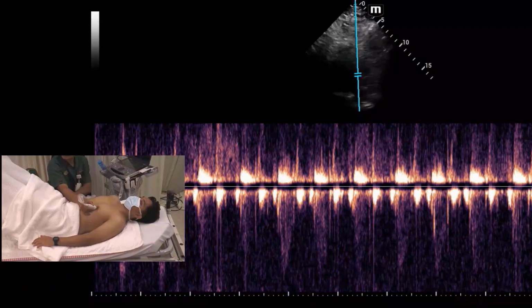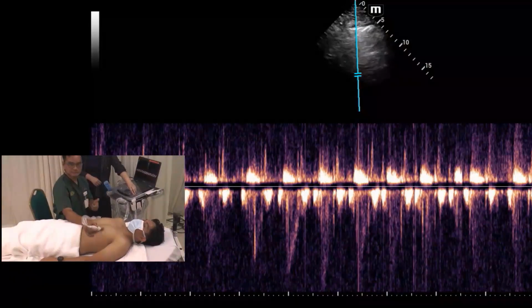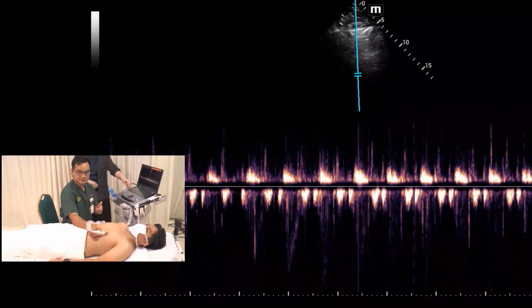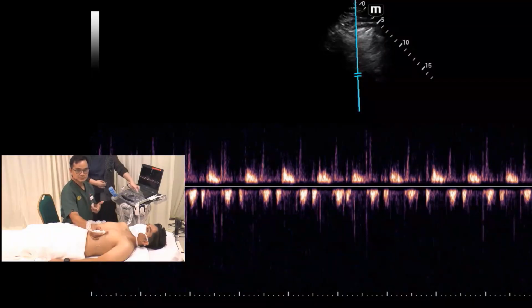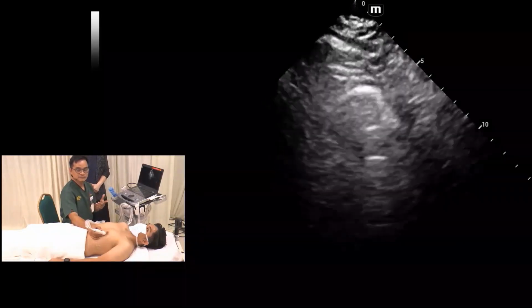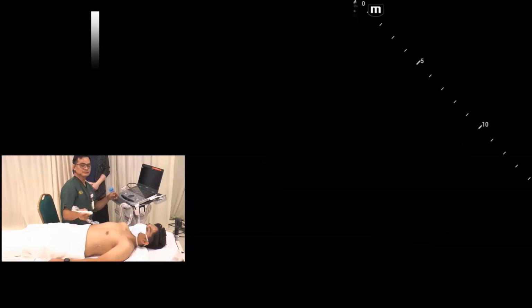Okay, can you see that? Right. So next, thank you. Right. So things that are discussed by me. Okay. Number one, we look at the step one, looking at the possible pre-existing cardiac disease, right? The possible chronicity of the heart. The etiology, basically looking at the valve, for example, in acute carditis, right? Number two, we look at the possibility of, for example, whether the patient needs the fluid or not, looking at fluid responsiveness, looking at the fluid assessment, right?